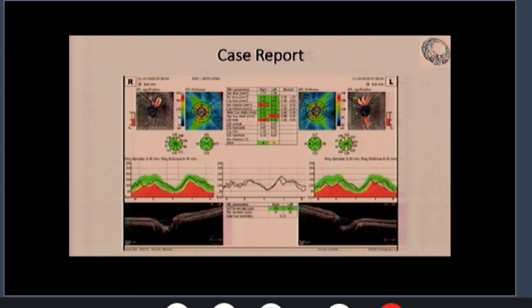You will say, well, it's not very high. Yes, but there is a difference between the eyes of more than 4 millimeters of mercury. Remember that every asymmetry in the eyes should be observed carefully. And you also had, as she said, very good, a difference between the OCTs.